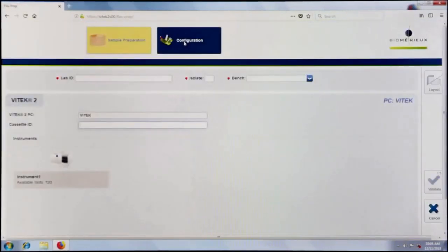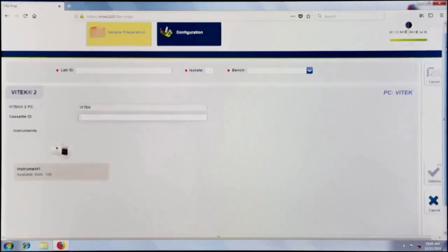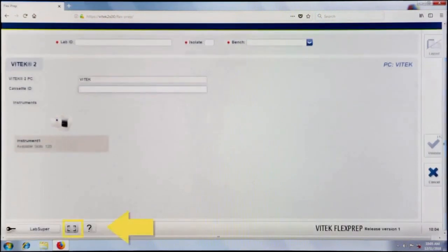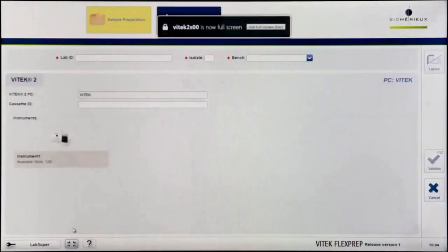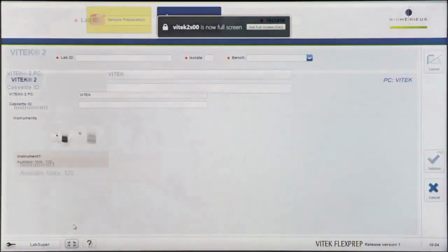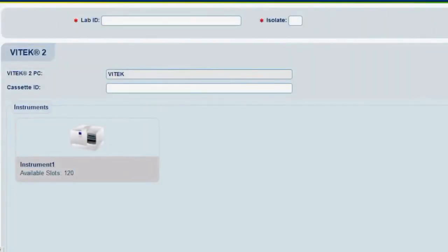By default, the sample preparation screen will display. Click on the To Full Screen button every time that FlexPrep is launched. This is necessary for optimal screen display and workflow.